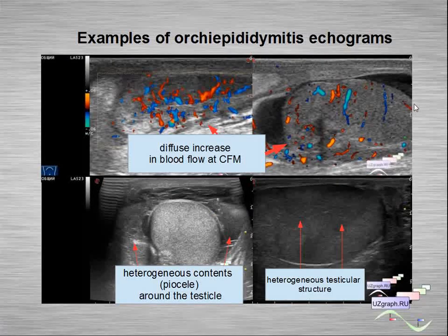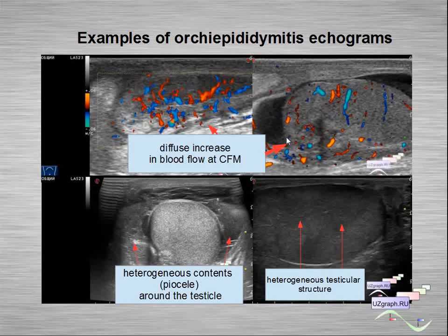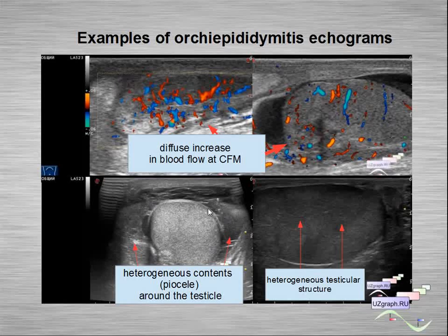Examples of orchido-epididymitis echograms: we can see an enlarged epididymis with increased blood flow in the epididymis and testicle. We can see heterogeneous content around the testicle — this is a pyocele. We can also see a heterogeneous testicular structure in orchido-epididymitis.